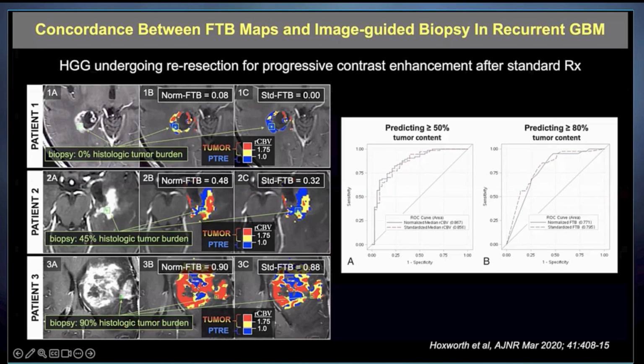Histology found that there was an admixture, about 50-50, of the presence of tumor and post-treatment effect. And then this is another in patient 3, an area where we took a biopsy from an area with no blue at all. It was all either red or yellow. And again, it showed essentially all of the biopsy contained tumor with essentially no post-treatment effect. So these are just illustrations, again, confirming the visual mapping of the histologic heterogeneity and how it is congruent with the biopsy results.